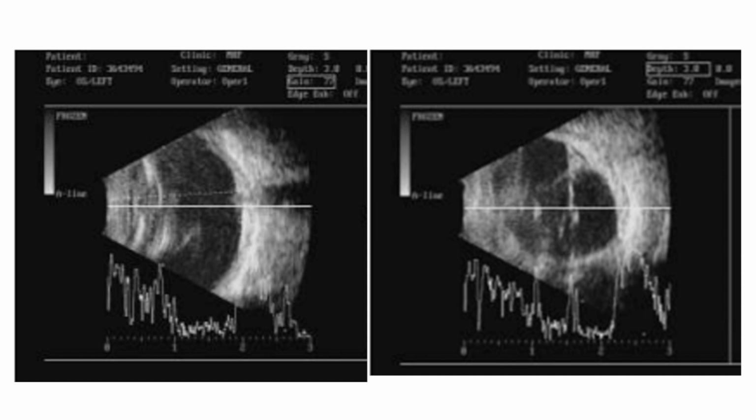But the ultrasound shows the vitreous cavity has a few low reflective dot echoes along with membranous echoes extending from the posterior part of the lens, with clump echoes of dot echoes. The membranous echoes extend from that clump of echoes towards the optic nerve head. So clinically the diagnosis was made of toxocara.